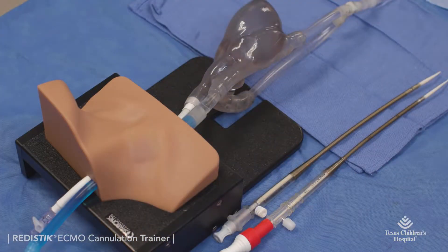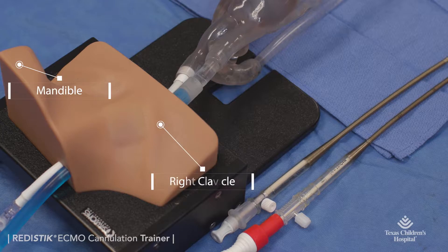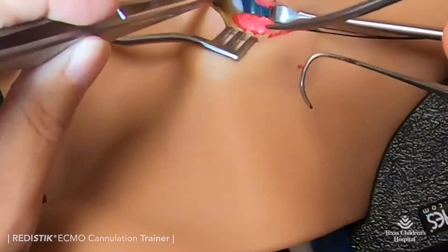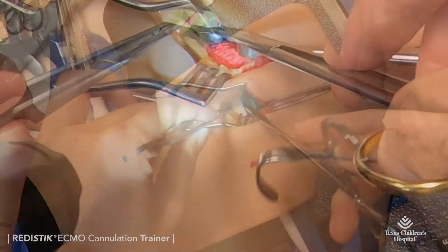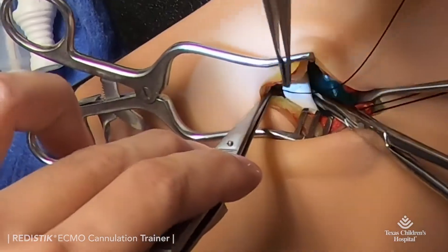We created a two-component trainer to include the heart and neck. The neck is for single use and exhibits anatomically accurate landmarks such as the mandible, clavicle, and realistic tissue layers including skin, platysma, fat, and sternocleidomastoid muscle, emulating real-life experiences for cutting, spreading, or laterally retracting the sternocleidomastoid muscle to expose the vessels.